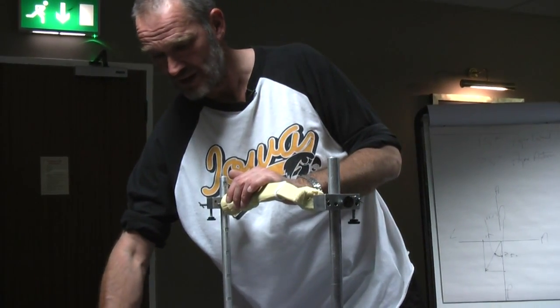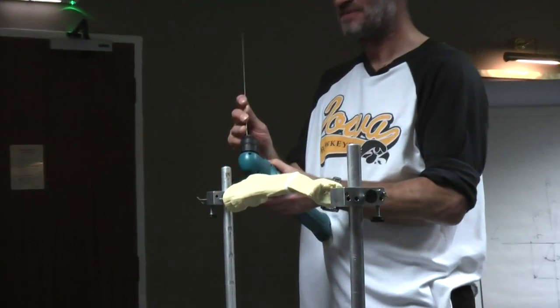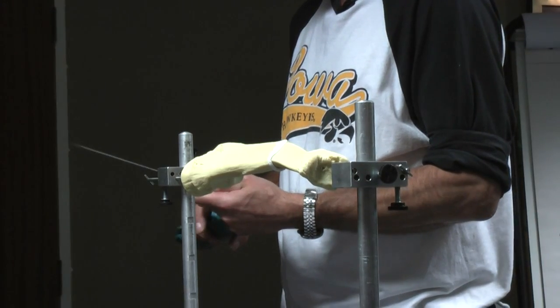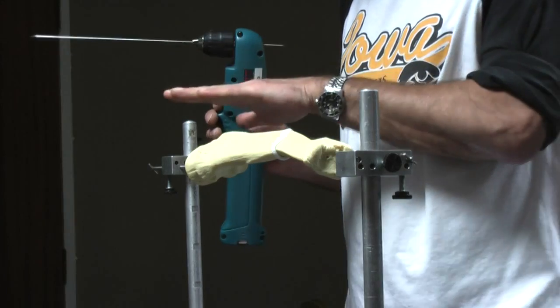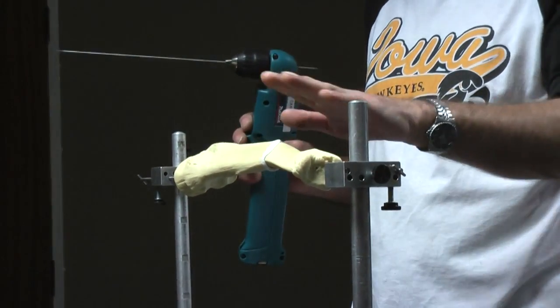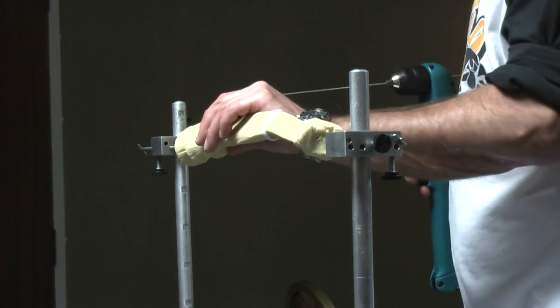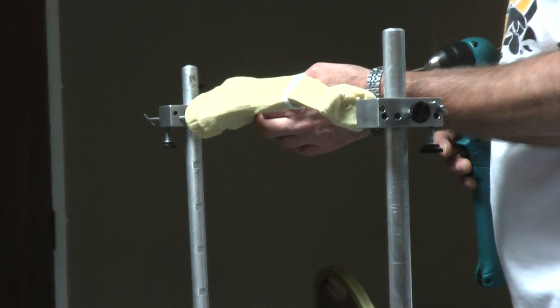is just drop in some wires. And this is when you remember that you did check the drill in the battery in the drill, and it is working. Okay, the reason I think it's really useful to put the patella vertical and the tubercle pointing at the ceiling and the tibia flat, just makes it really easy to put in your first wire. Okay? And your first wire, your proximal reference wire, is through the tibia, at the level of the fibular head.